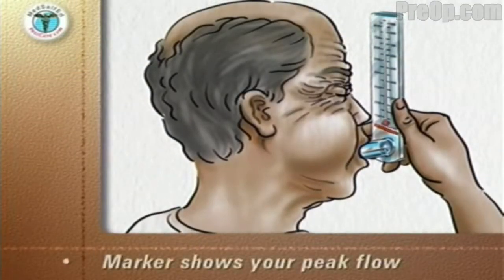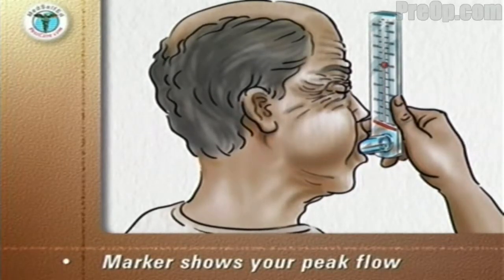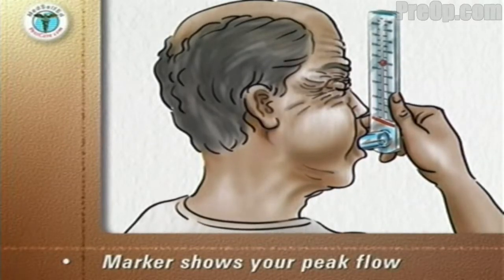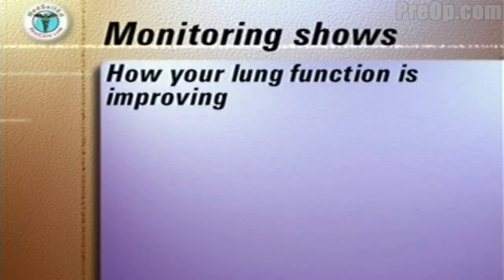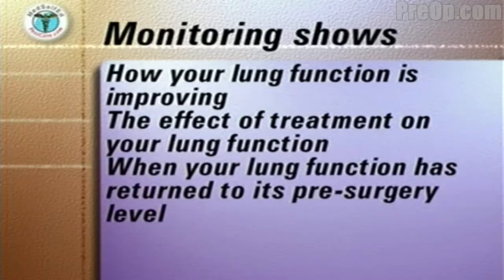The meter has a marker that slides up the scale as you blow out. The better your lung function, the harder you will be able to blow out and the higher your peak flow score will be. Monitoring your peak flow numbers shows how your lung function is improving, the effect of such treatments as breathing exercises on your lung function, and when your lung function has returned to its pre-surgery level.